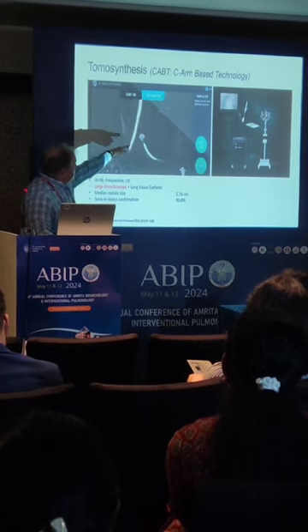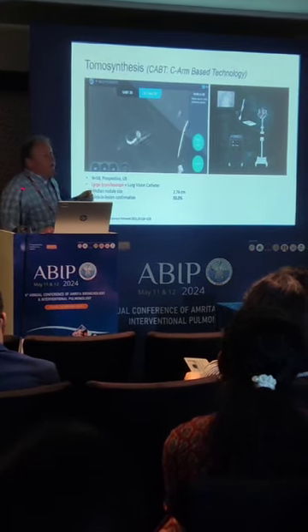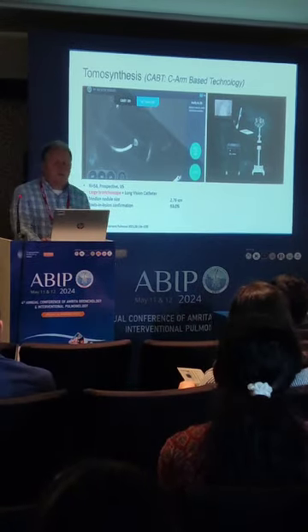Preoperative planning. And it moves this quickly. This hasn't been sped up.